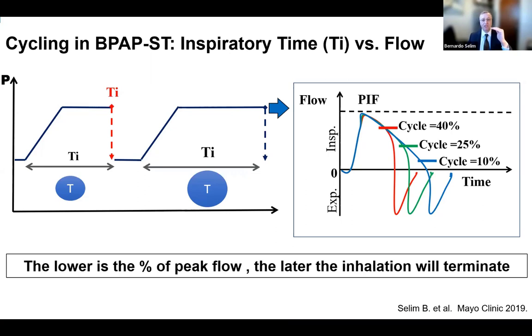Typical example in COPDers. Again, you don't want to spend them too much in inhalation. On the opposite, you can cut off that flow at the end. And that is when you want this patient to be taking as long a breath as possible, and you allow the flow to finish the inhalation up to the end. And that is in typical obesity hypoventilation syndrome and neuromuscular disease patients.